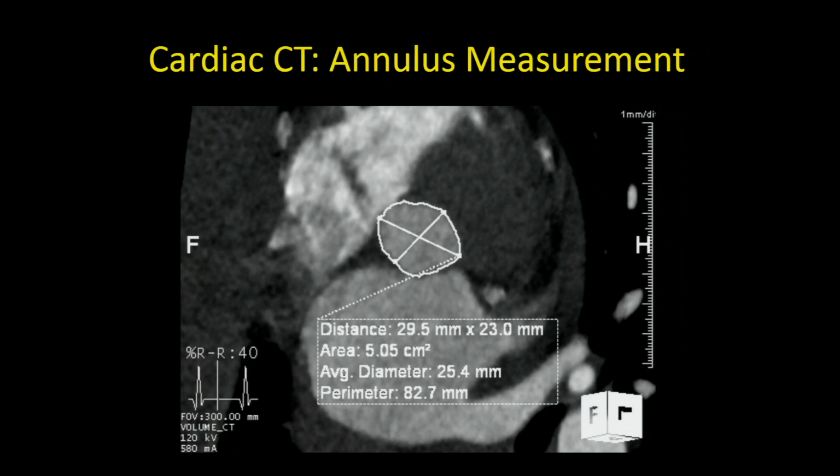So this is one of the examples of what the CT scan images look like. This is a scan looking at the exact aortic annulus. This is done in a really precise way. And then we take an outline of the annulus, take a minimum and maximum diameter of the annulus, and then an area, and use those measurements to help fit the valve to the right size prosthesis.